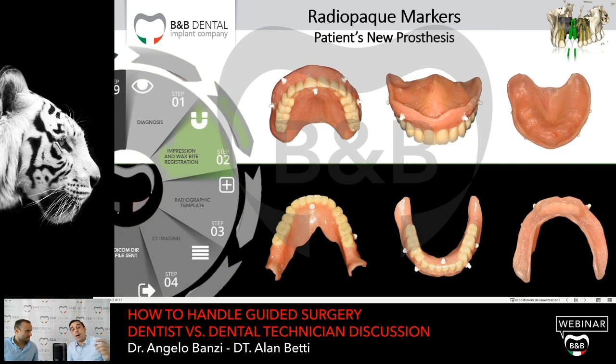It is a double CBCT system. But even in this case, we have 2 different DICOM files. We take the first DICOM files of the patient wearing the radiological template, and we load them on our software. For the second image, the second DICOM image, we transform the radiological template into STL files. So we have the possibility to match the 2 different files, DICOM file and STL file, by our radiopaque markers.